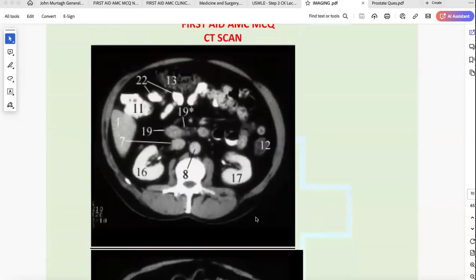And if we go down a little bit, now you can see just a little bit of liver is visible, but now the kidney is more visible on the side. And in here, you can also visualize lots of bowel loops. The bowel loops on the periphery are the large intestine. And what's in the center or in the middle will be the small intestine. Okay.